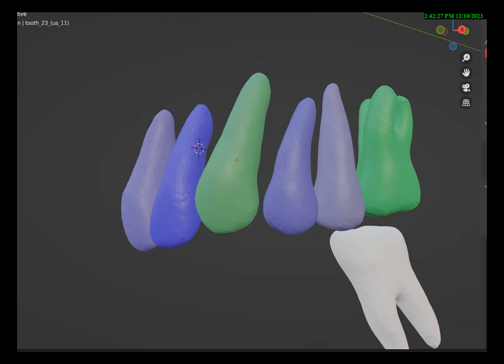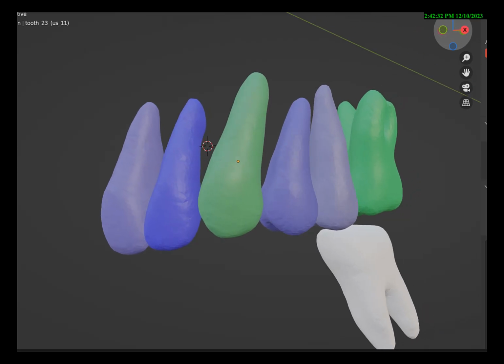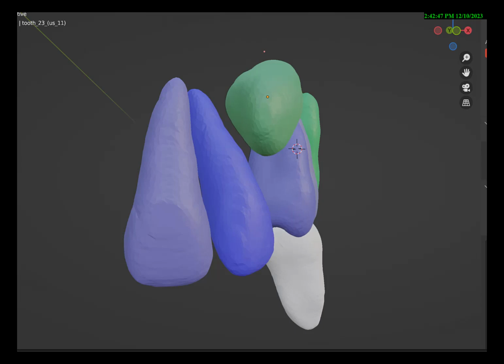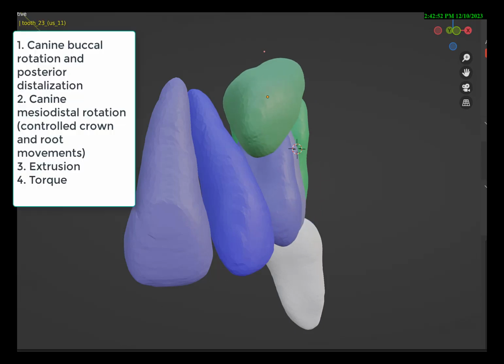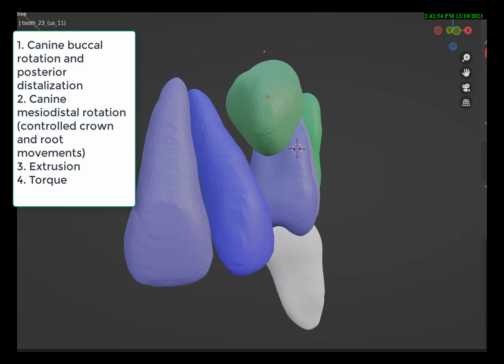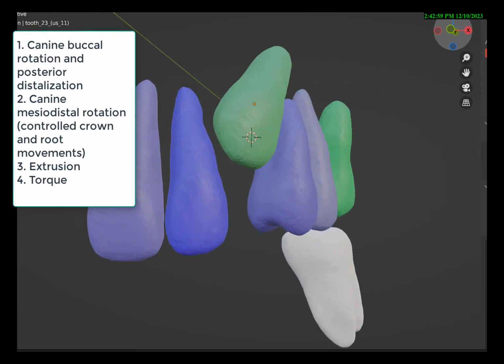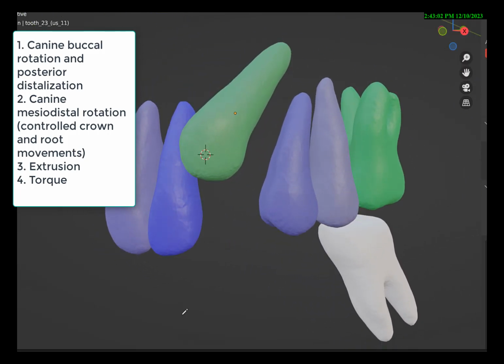Then the canine is correctly positioned in the AP plane, but many times what needs to be done is to torque the tooth into its position without putting any buccal torque on this tooth. So if you look at the movements, they are much more complicated than just pulling the tooth down. First is rotation and distalization. Second is rotation and root and crown movement into the space.